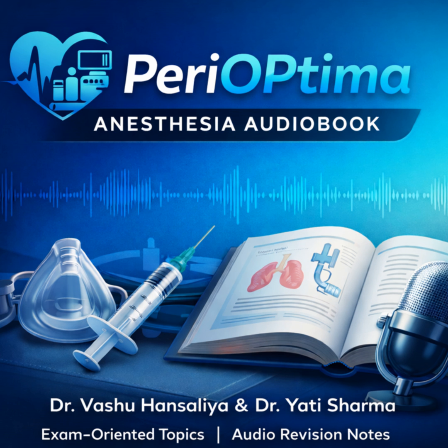Without a doubt, the interface. This is the firewall. It's the mechanical and physical separation between the waste disposal system and the patient's breathing system. You have to stress that firewall function. The interface is essential for preventing the transmission of pressure back into the patient's circuit. It doesn't matter if it's positive pressure from a blocked line or negative pressure from an over-eager active system.